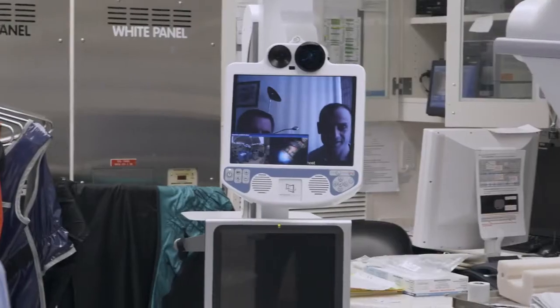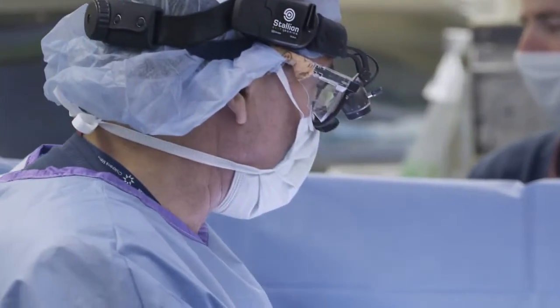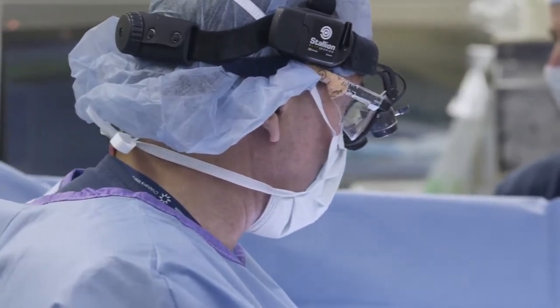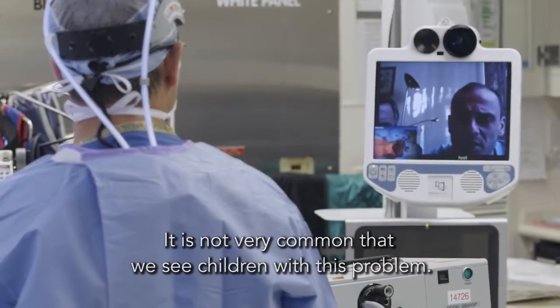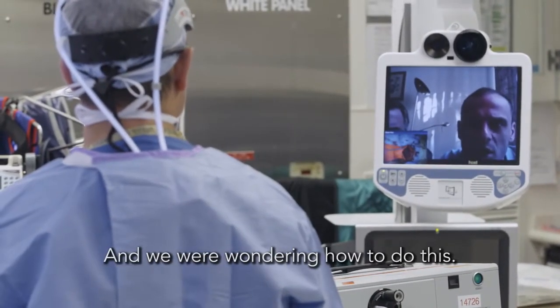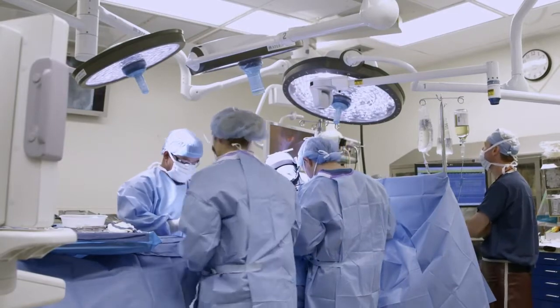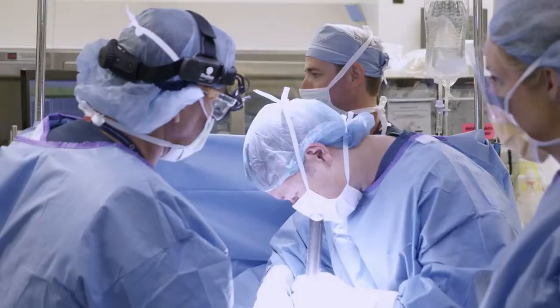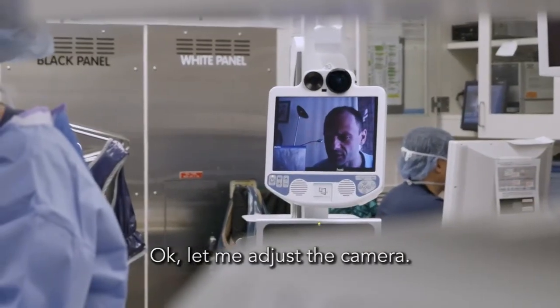Andre, good morning. How are you? Have you had very many children with occipital fusions and instrumentation? First couple of children with this problem. We want to learn how to do it. So what we're doing, we're just going to create a small pilot hole. So Andre, right now, we're trying to expose the C2-3 fused area.